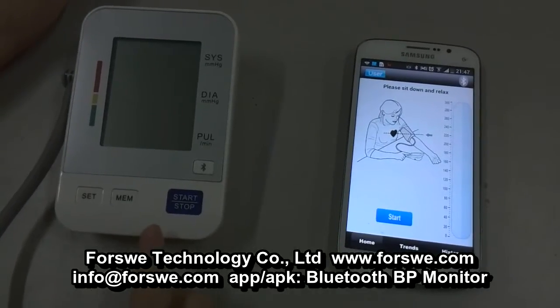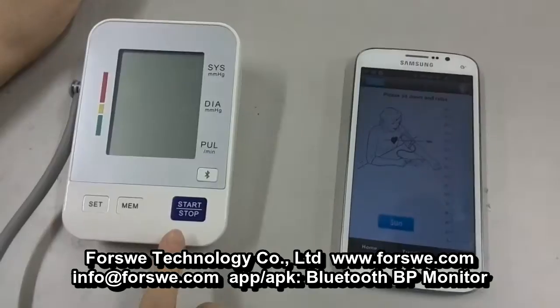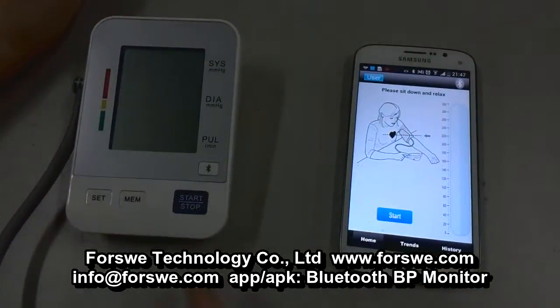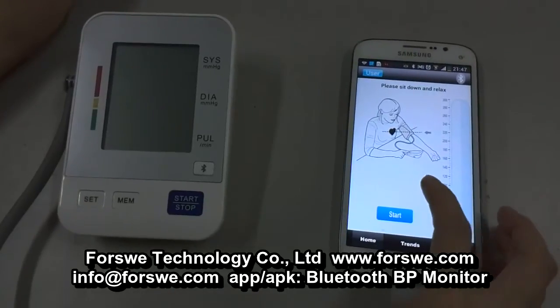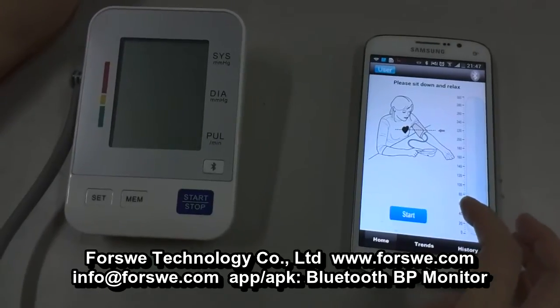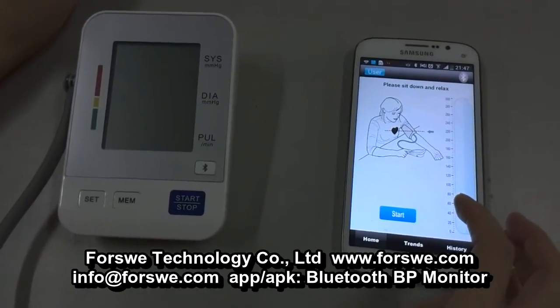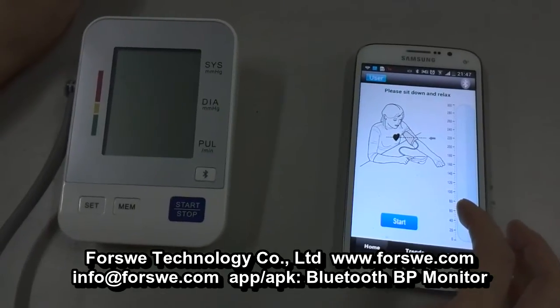This is our newly designed Bluetooth blood pressure monitor. It can be used with iOS and Android systems. Now let me show you how to operate on the Android system. You have to download the APK from Google Play. The software's name is Bluetooth BP Monitor.